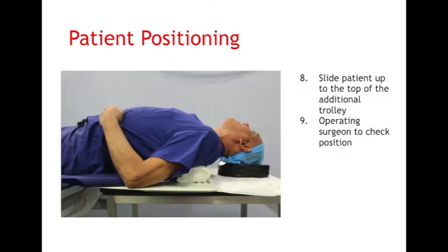Clearly, if the procedure is being performed in a dedicated operating theatre, these additional positioning steps are not required. Here, the suitable patient position is simulated with neck extension, a stable head ring, and the gap between the ITU mattress and operating trolley bridged with a pat slide. While some form of pressure relief would obviously be ideal, it was felt that this would complicate patient transfer, and for a short procedure, the hard board would be tolerated.